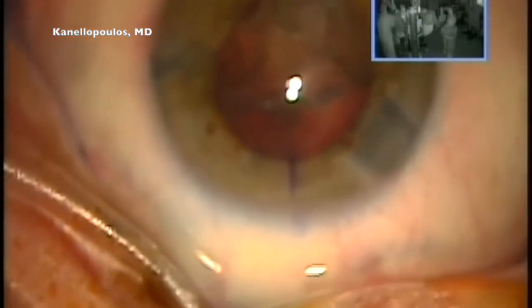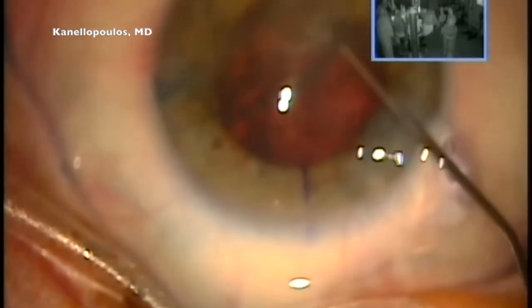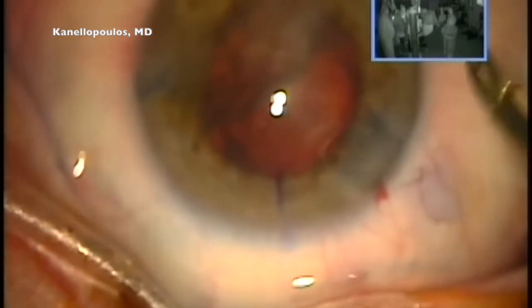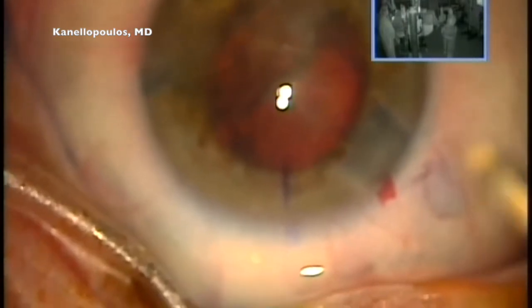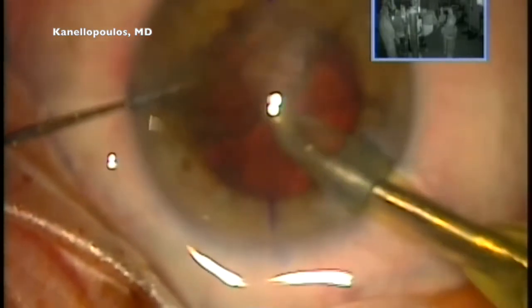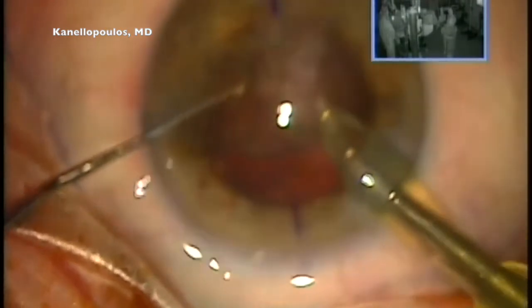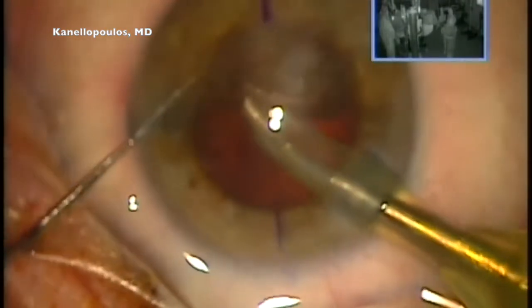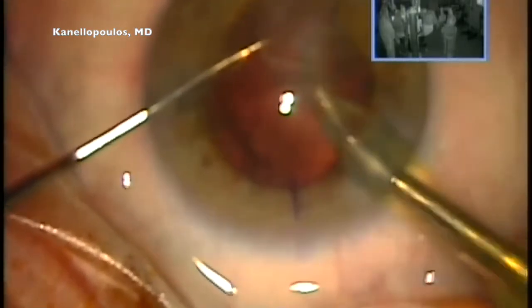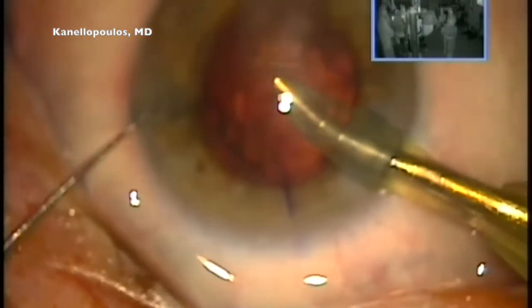We're dancing around a little from the nucleus, so this is where I will always, and without second thought, refill the chamber with visco to enlarge my capsule back, push back the posterior capsule as far as possible from the level that we're working, and thus reduce the possibility of it being entrapped by my phaco tip. Also stabilize the nucleus that I'm emulsifying at this point. And third, get a better dilatation of the pupil. And we can all appreciate the higher stability that this accomplished in the anterior chamber.